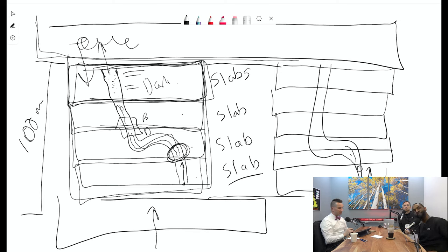There's another method that you can do, but not all vendors have this. It's called TONE, the tone ramp. The idea here is that across this individual slab, they change the flip angle. So maybe you start out with a 20-degree flip angle here, and then an 18, and then a 17, 16, and 15. As the blood is flowing up here, we give it less of a flip angle, less RF, so there's less of a saturation effect by the time we excite that next slab. Typically, you'll want to use either one of these techniques, either adding more slabs or using TONE to adjust the flip angle, when the patient has slow flow.